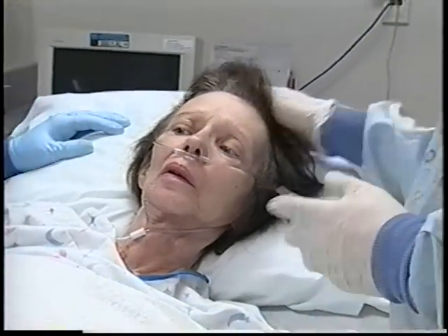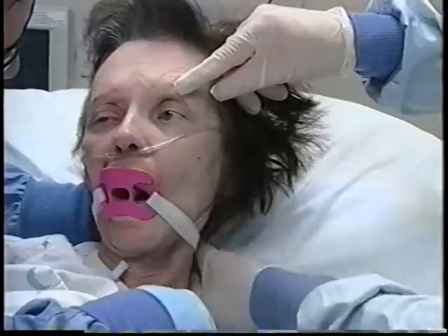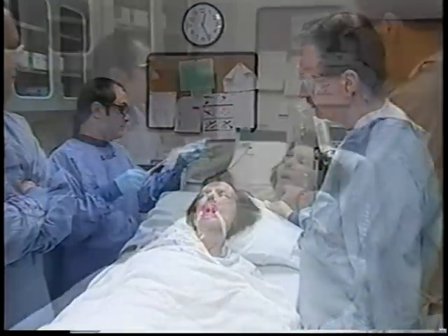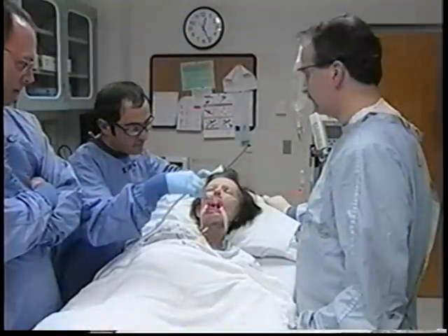Oxygen may be provided via nasal cannula and the oxygen saturation levels are monitored by pulse oximetry. The posterior pharynx is anesthetized and a bite block is positioned in the mouth. Particular attention is paid to posterior pharyngeal suctioning. These preliminary aspects of the PEG procedure relating to patient positioning, oxygenation, and suctioning are critical.